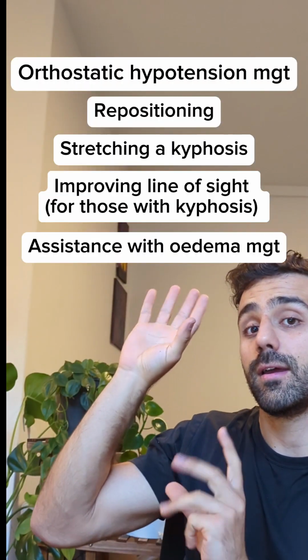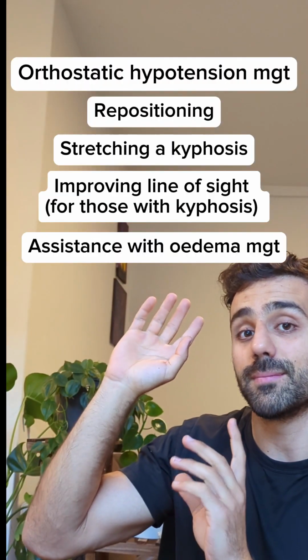Now there are a bunch of benefits of posterior tilt, but I need to keep my videos short. So here they are. I hope you enjoy them. Look into them in your own time.